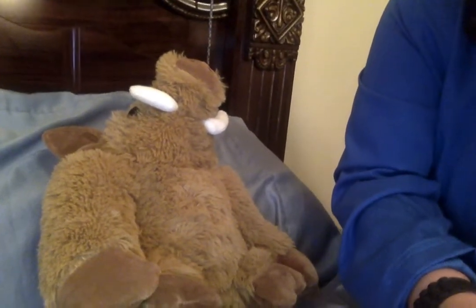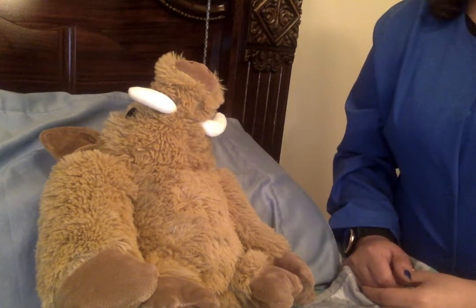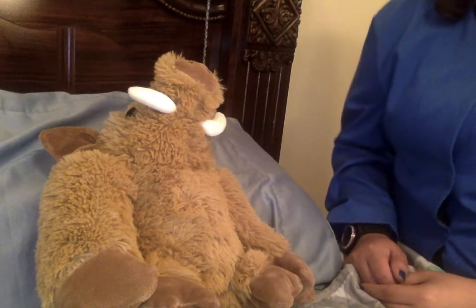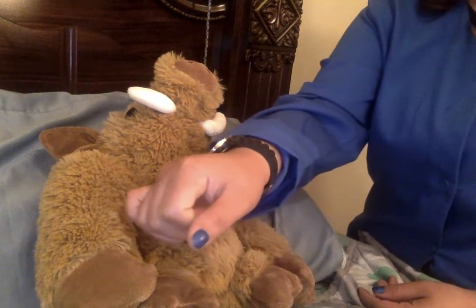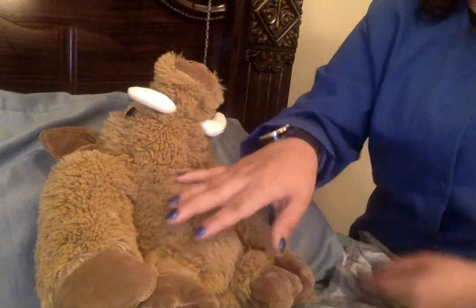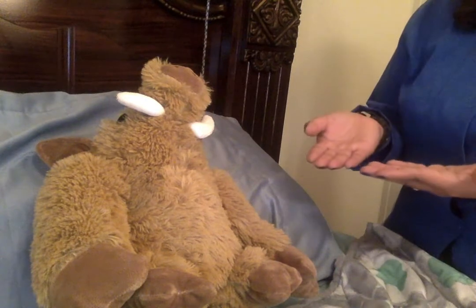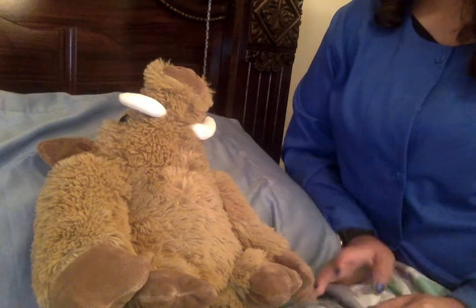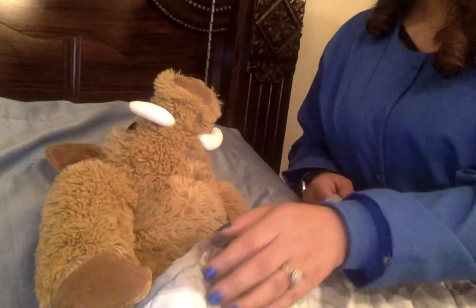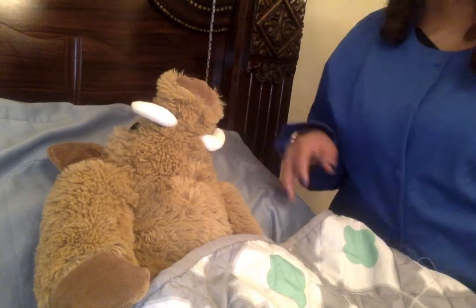Okay. So the next thing we're going to do is examine the patient by using a bladder scanner, where we're going to palpate the patient's bladder for distension. We're going to raise the bed to a comfortable position. Then we are going to drape the patient for privacy, and place a waterproof absorbent blue pad or towel underneath the patient.